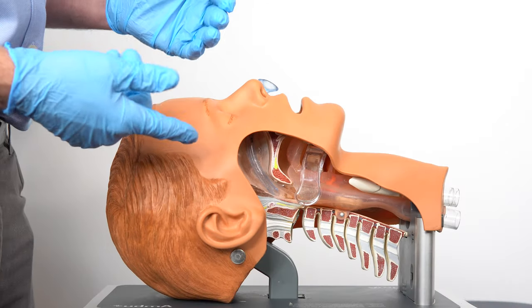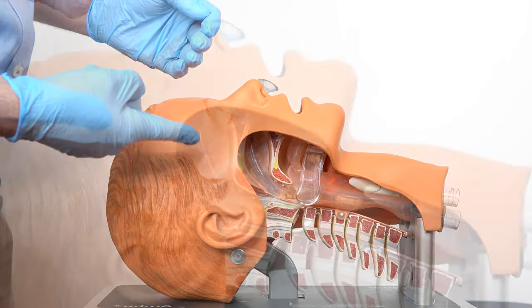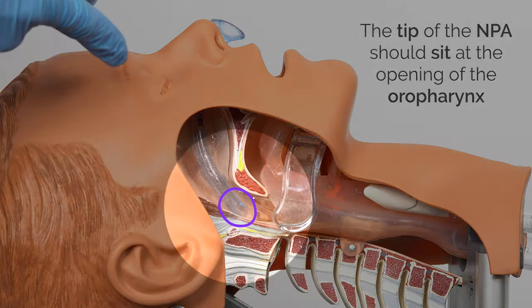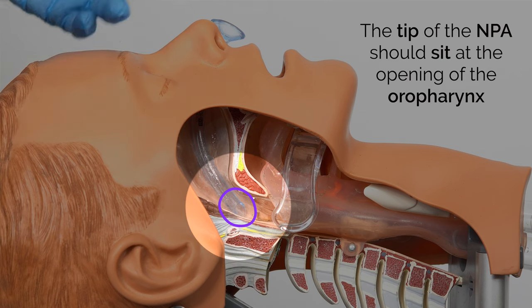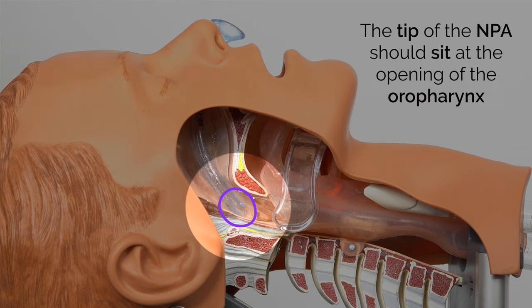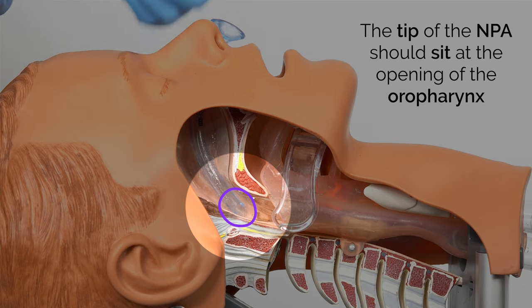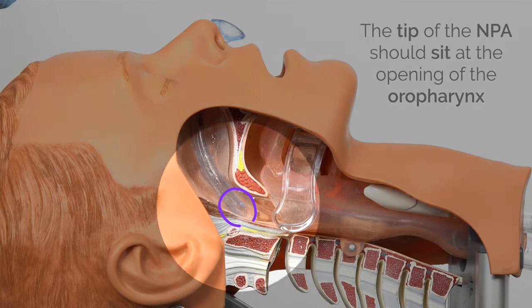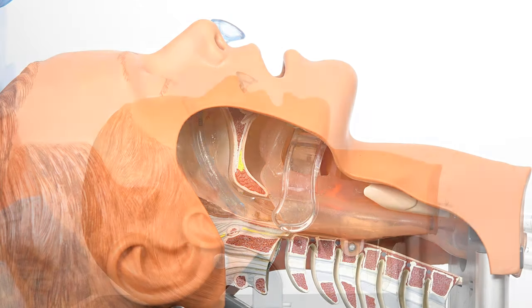You can see in the side cut where the tip of the tube is. If the tube was too long, potentially the patient may start gagging or coughing, in which case you'd remove the tube and replace it with a smaller size.